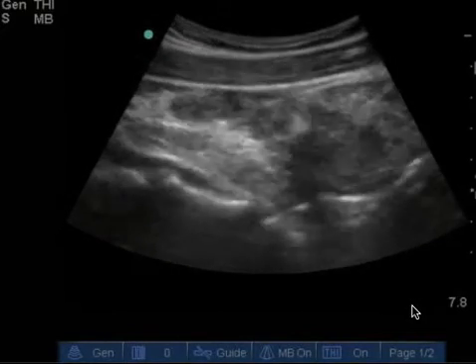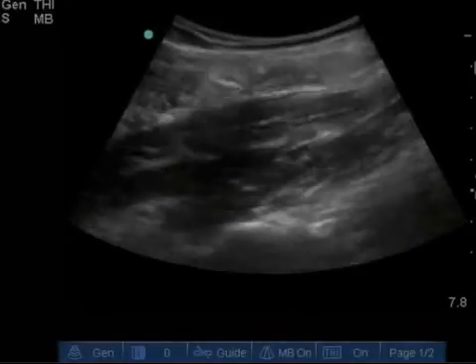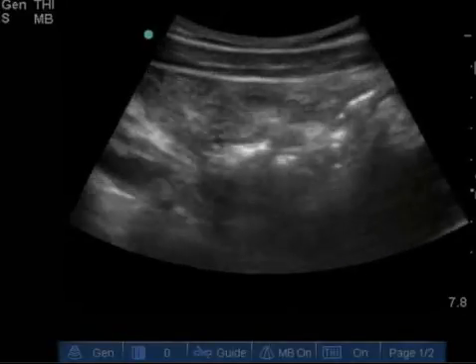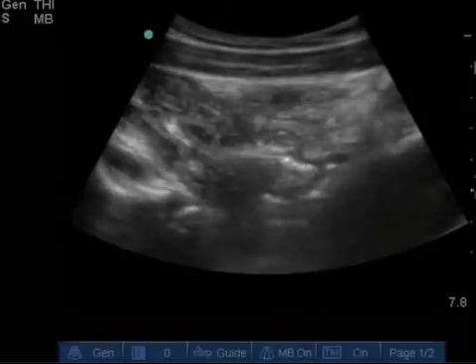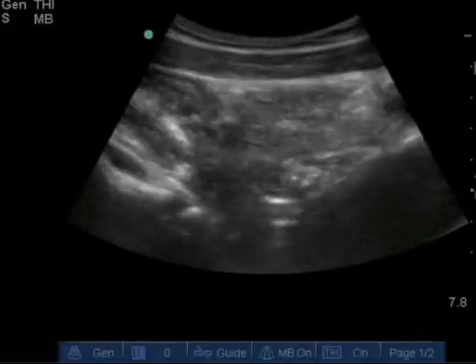You want to increase your depth just so you can get a better picture of where the uterus is. In all the clips, I don't see the uterus. If you don't see the uterus in a patient, it's hard to say if it's negative or positive. This is viewed as a technically limited study — you can't really tell if there is or is not an IUP if you can't see the uterus.